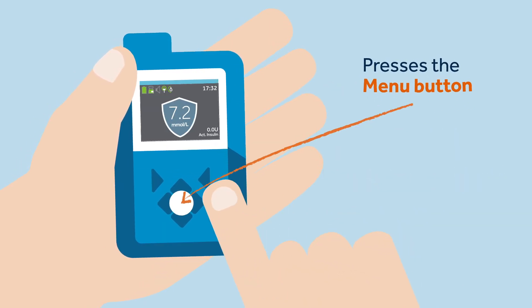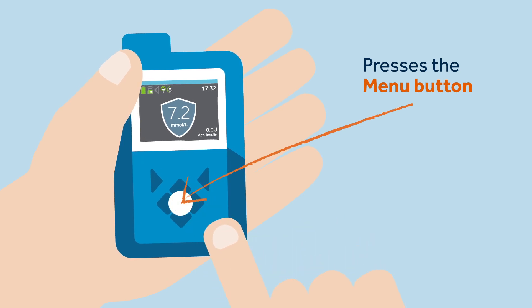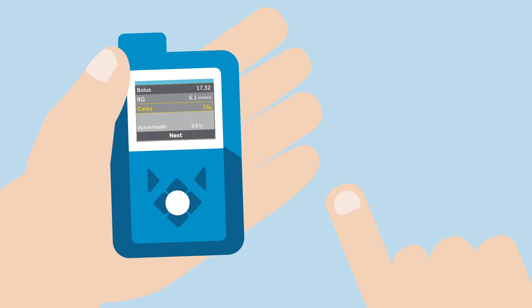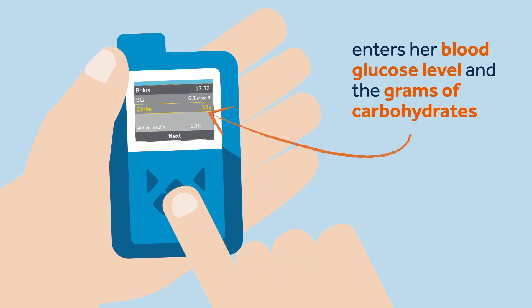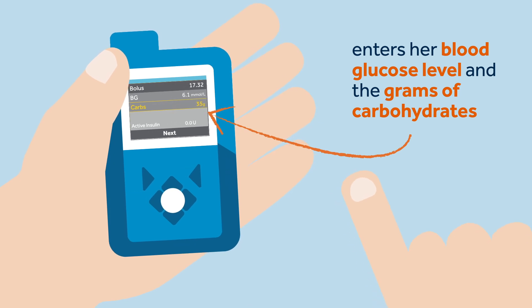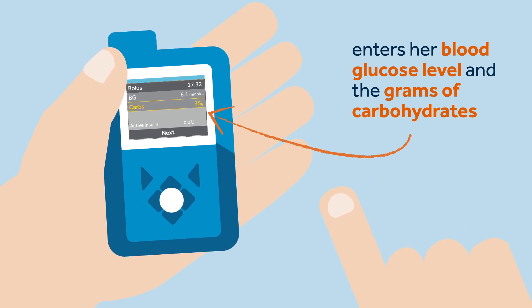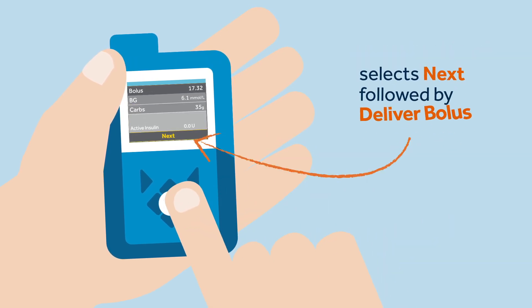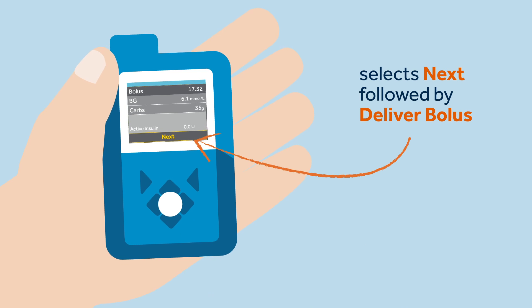Once the correct configuration is saved, Sophie presses the menu button and selects bolus. She then enters her blood glucose level and the grams of carbohydrates that she plans to eat. If you are using the Essentia Contour Next 2.4m, the BG will be populated directly. She then selects Next, followed by Deliver Bolus.